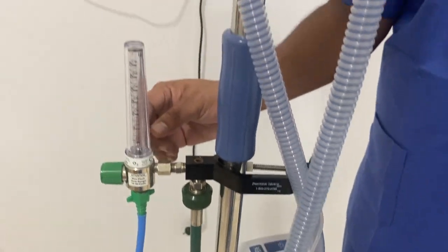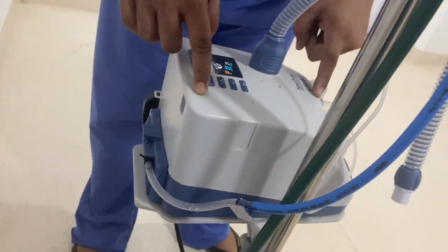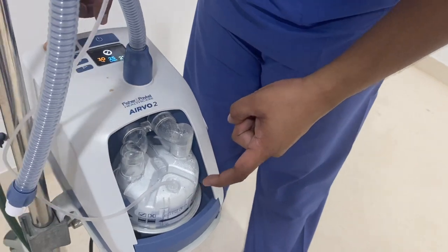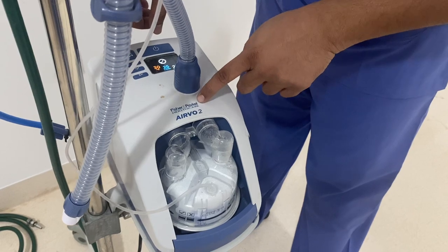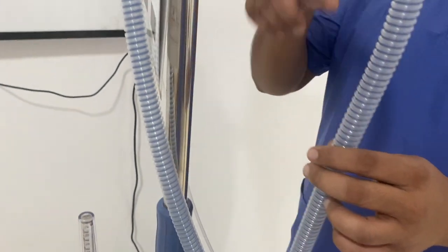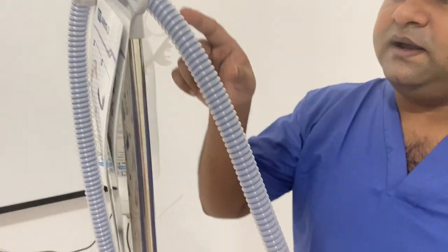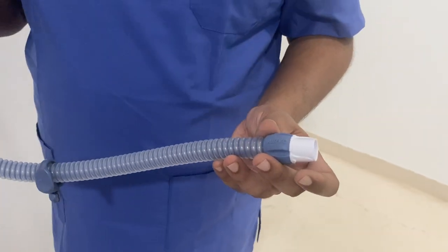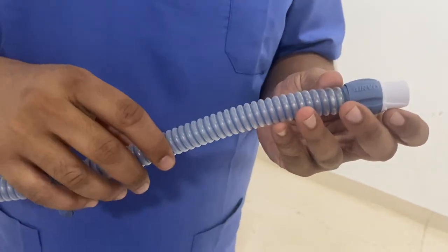So the oxygen from the flow meter goes into the humidifier, then through this port oxygen comes into the water chamber. From the water chamber, the air flow goes back into the humidifier and then to the patient through this air piece. The air piece has an inline heated wire throughout its length that maintains the temperature and humidity of the air flow. This prevents the condensation of water vapor in this tube.